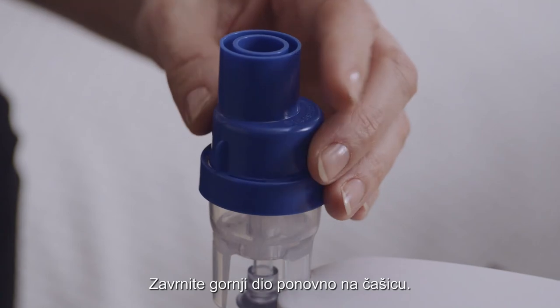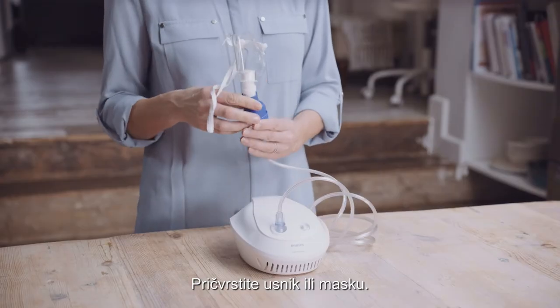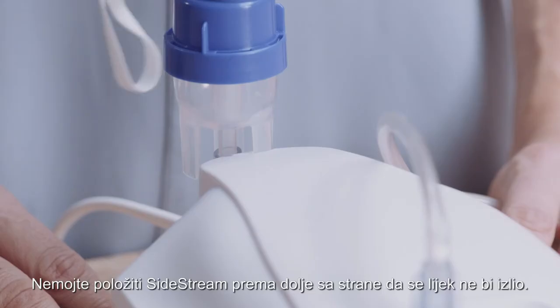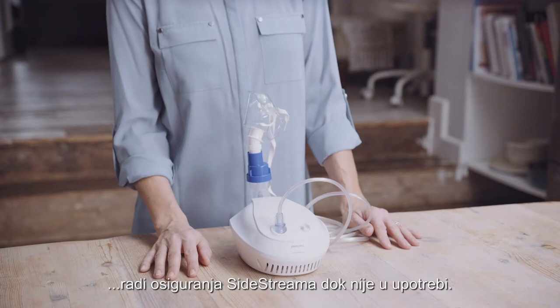Screw the top back onto the Nebuliser cup and attach either the Nebuliser mouthpiece or the face mask. Don't lay the Sidestream down on its side because the medication will spill out. You can use the parking post on your device for securing the Sidestream when not in use.